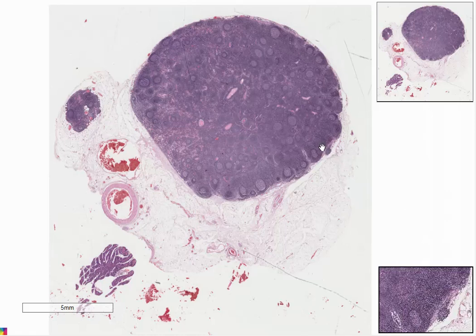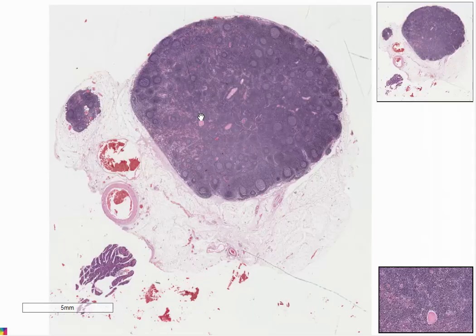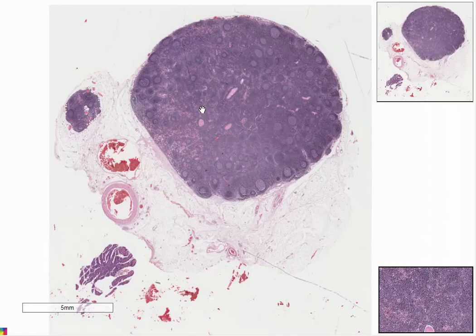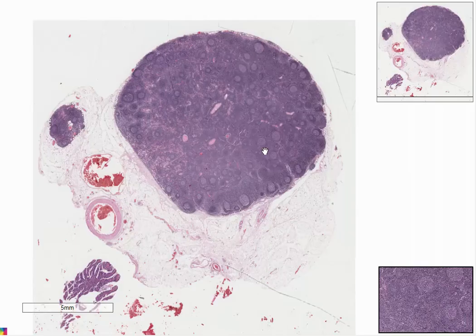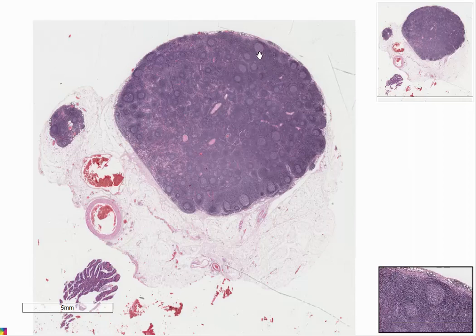We are looking at a lymph node today. We'll keep it short and simple, but there is still a lot of detail concerning this organ and how it functions for us in our body. So what we have here is one lymph node, and I remember I got this as my normal histology exam question to identify it and explain, and most of it was asked around germinal centers, which is what I'll show you.